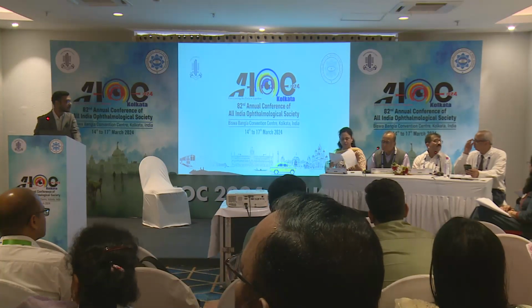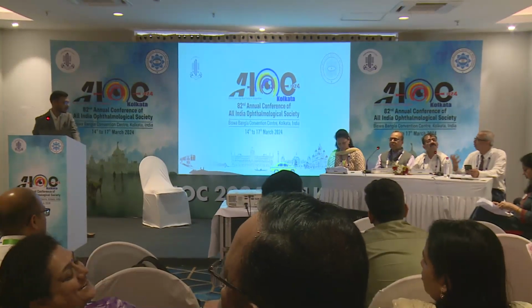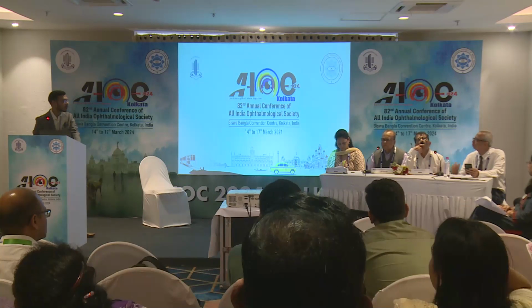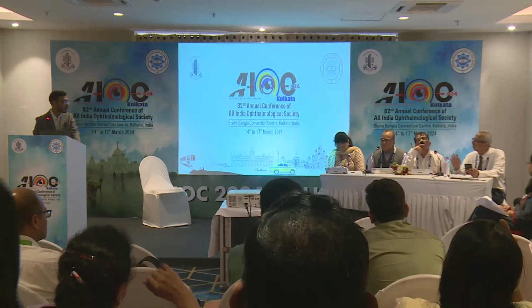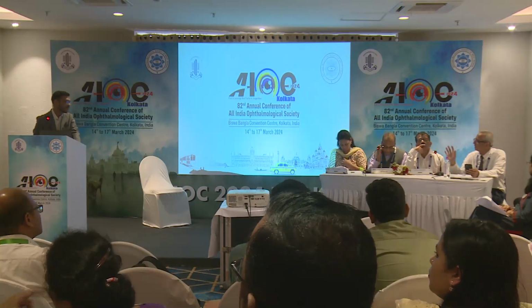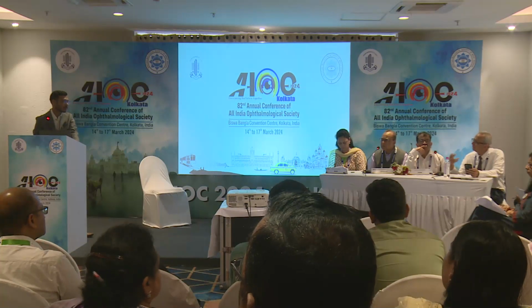I don't know whether you actually took a look at the deviation maps of ganglion cell, because that's the first thing that you will see. If you have a moderate degree of RNFL loss, the deviation map of ganglion cell loss would just show you significant loss. So I don't know whether it had something to do with the machine and whether it didn't give you the deviation maps, and so you couldn't, but that's something you need to go back and take a look at once again.